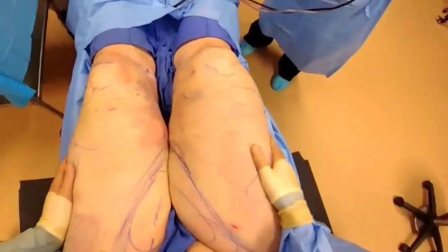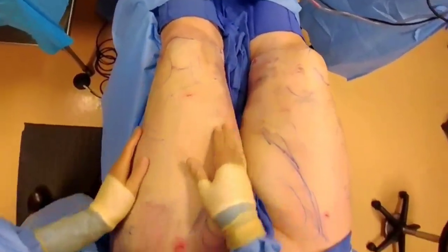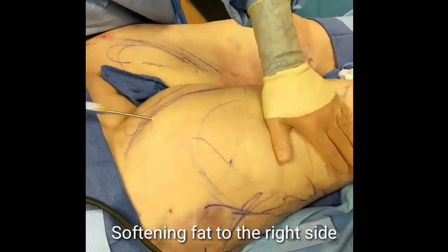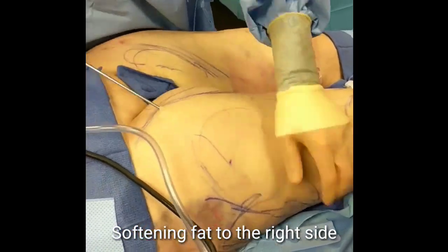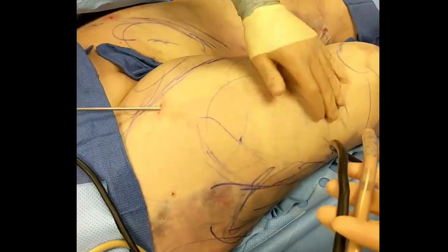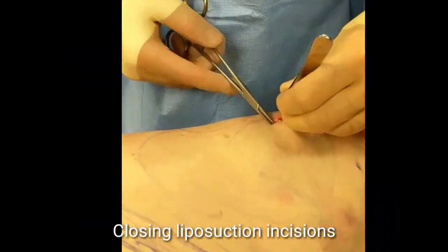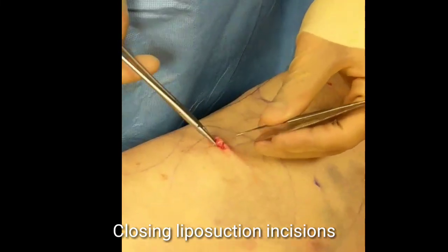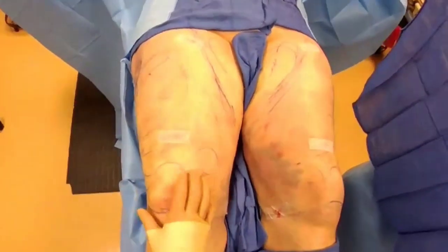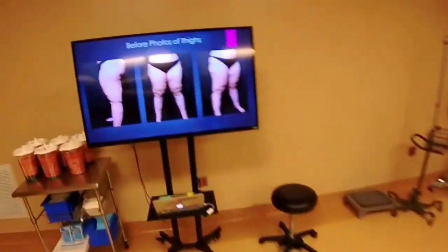Making progress — huge difference. One leg taken care of, the other one not yet. Kneecap starting to come to shape. We have knees — a little swollen, but knees nice, thighs a lot better contour. This is where she started off.